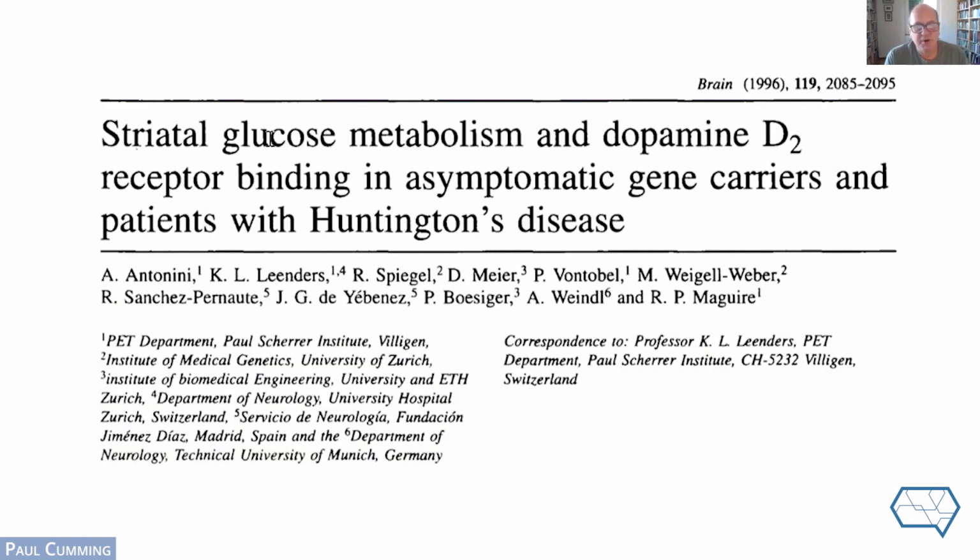So I've talked only about FDG, but I've pointed out that one of the very early findings in metabolic PET, in addition to the hypofrontality, is the loss of metabolism in the basal ganglia, which is a vulnerable region in the brain. And the basal ganglia, normally referring to the caudate and putamen, is the dopamine-rich part of the brain that substantially degenerates in Huntington's disease, as could be seen in that gross anatomic specimen where there was practically none remaining. And that surely is responsible for the main part of the motor symptoms of Huntington's.